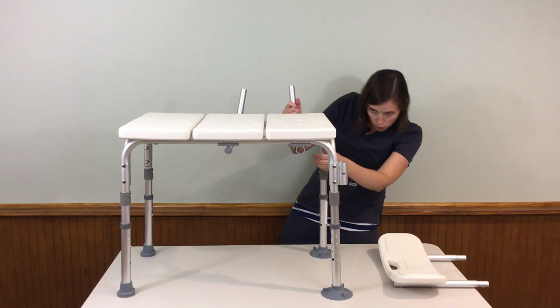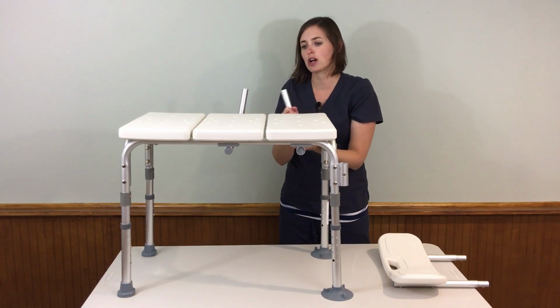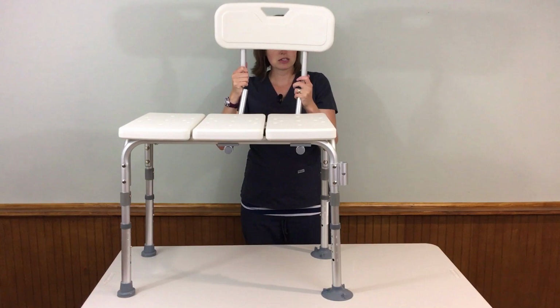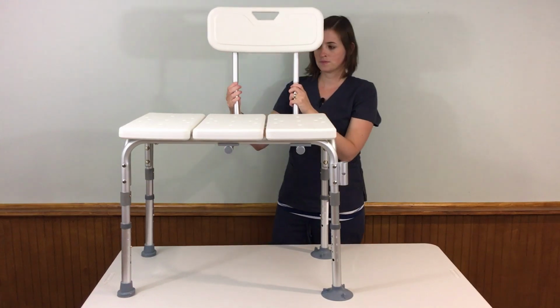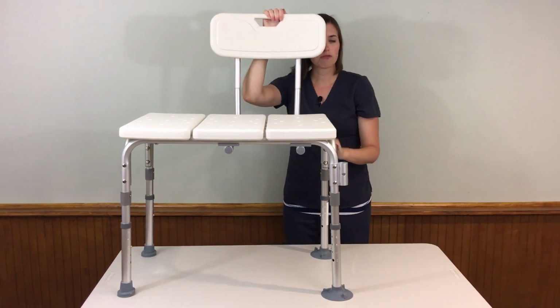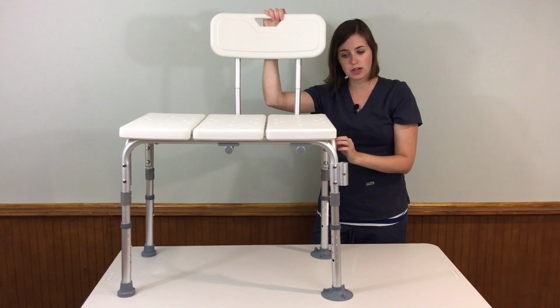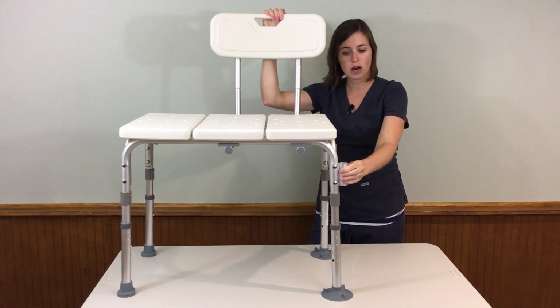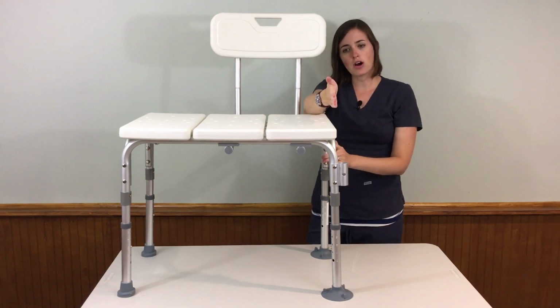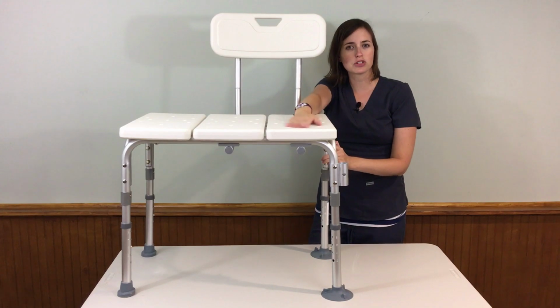These are going to have a little wiggle to them, because they're meant to be easy to switch around depending on how your shower setup is. Once those are in place, you're going to slide your backrest on, just like that. Check it all for sturdiness. Now again, if you had one of those armrests that goes right here, that would go into these two cylinders, and that would come up around here. You want the arc of it to be angled out. You don't want it angled in because it'll impede your space for sitting.